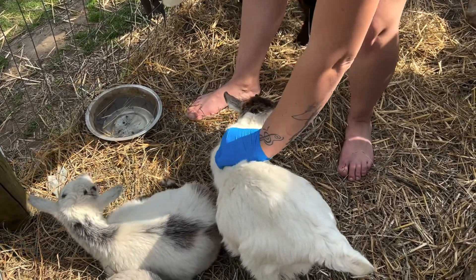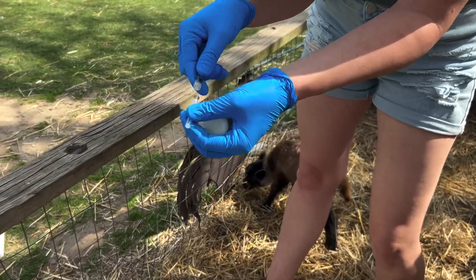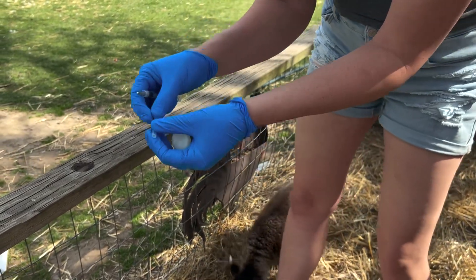I'm going to do it subcutaneously, which is the way my vets have shown me how, and so it's what I'm most comfortable with. Make sure the needle is attached — at least I know the needles can come off.